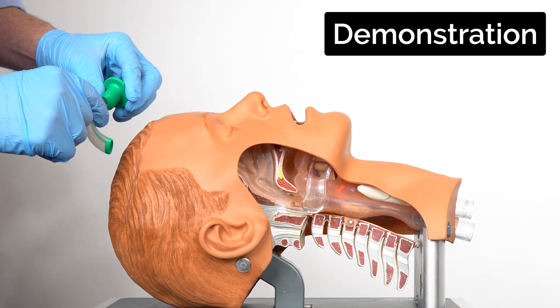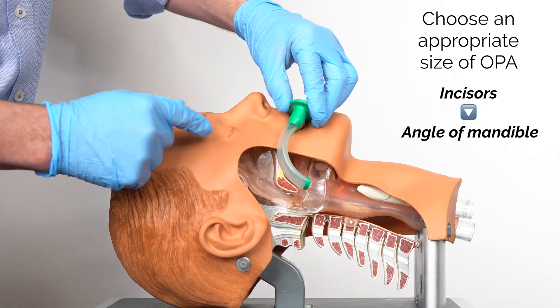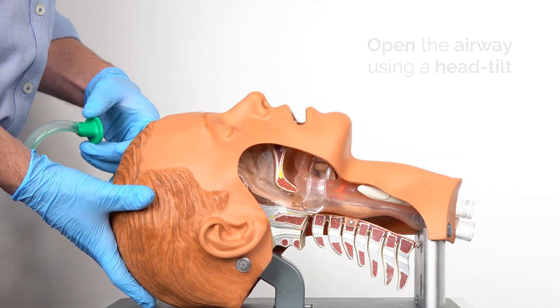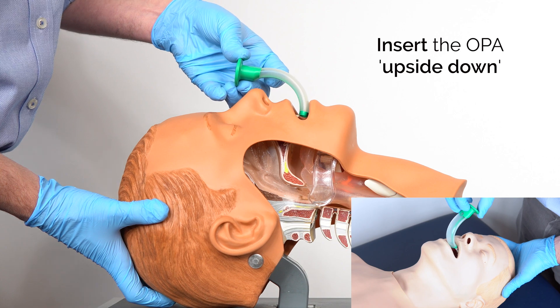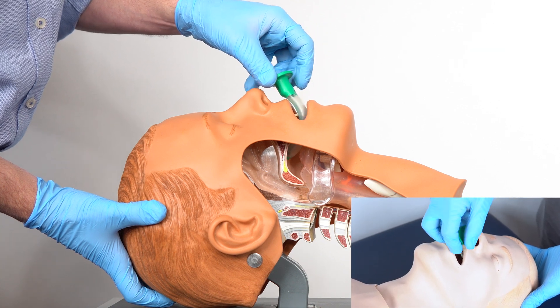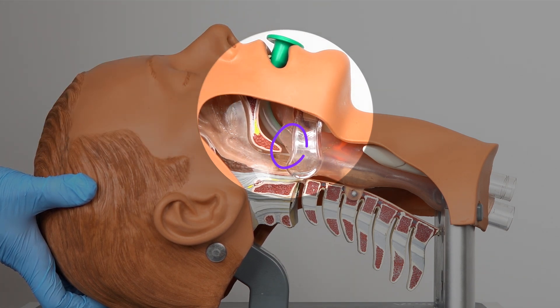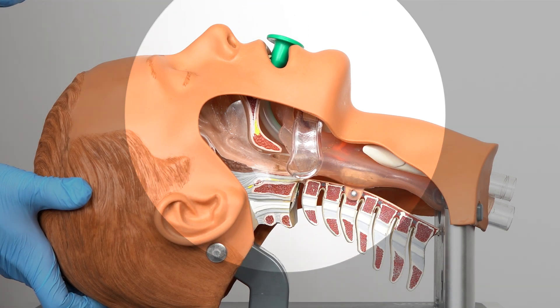For insertion of an oropharyngeal airway, I'm going to size it up first — I want the flange roughly level with the incisors and the curve finishing approximately at the angle of the mandible, so this is going to be about the right size. When I put it in I'm going to gently tilt the head slightly, insert this upside down to start with, let it drop into the mouth, and once it won't go any further, a gentle twist of 180 degrees. You can then see on this model how it sits neatly with the tip at the edge of the oropharynx, with the curve following the shape of the tongue but keeping the tongue out of the way from obstructing the airway.